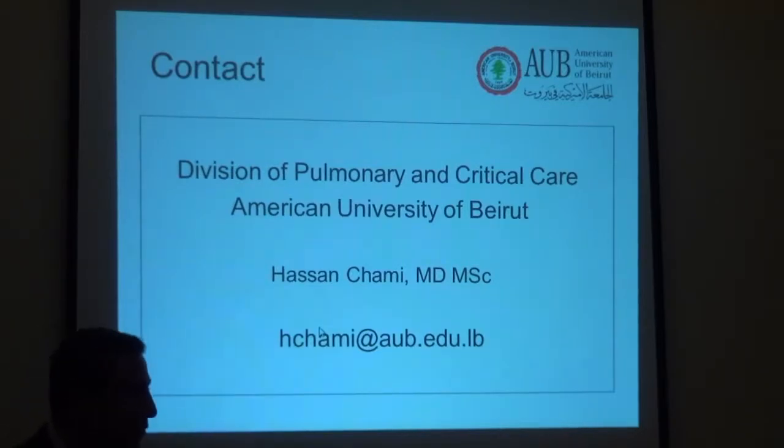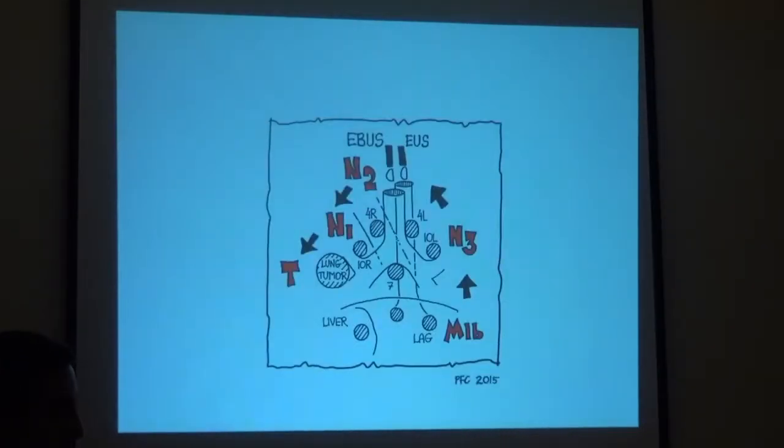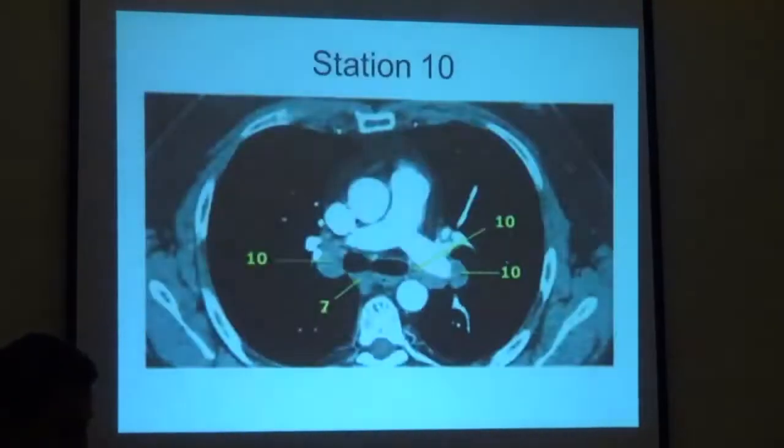What do you mean? Two and three are outside, four is above. How do you differentiate? Three is posterior. One is supraclavicular, two and three are at the same level, but you just have to turn your scope backward to the membranes. So once you're in, I'll show you.